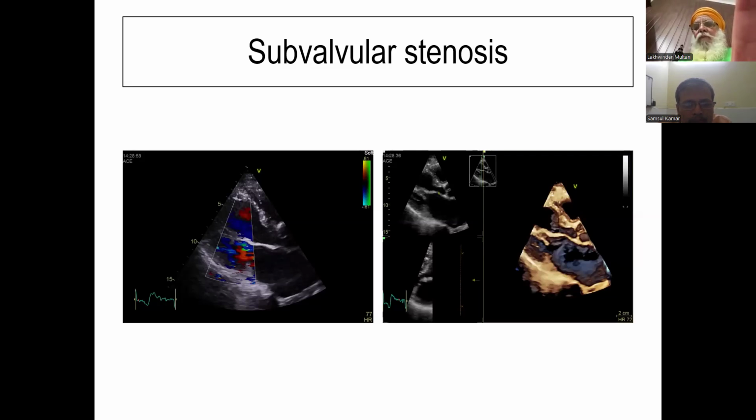Okay, sir. It's not a question of mid systole. Okay, sir. Sir, I have another question. You showed how we can measure the mitral valve area through the continuity equation. But in the continuity equation, we get the value of mitral valve area at the annulus level, mitral valve annular level. But we always measure the mitral valve tip measurement in case of MS. Then should we use the continuity equation for MS? I'll give you an answer in a better way.